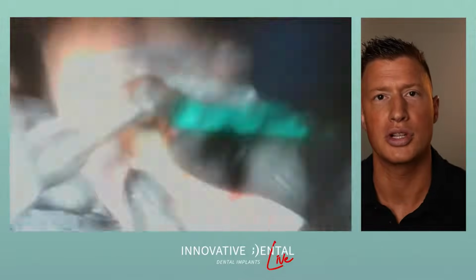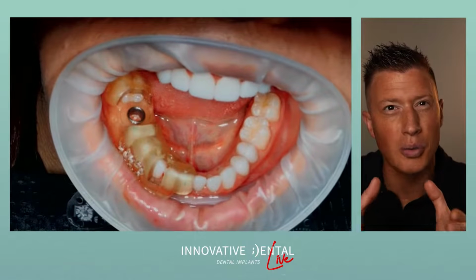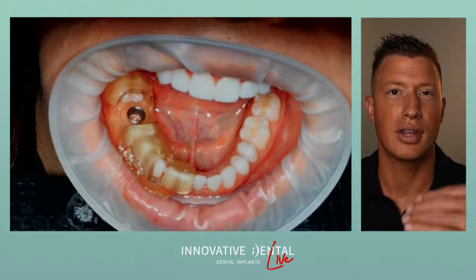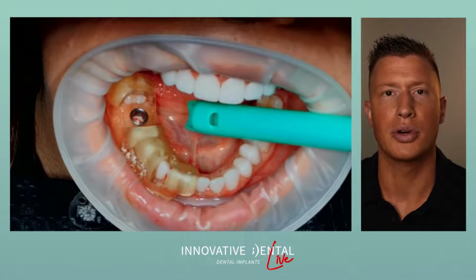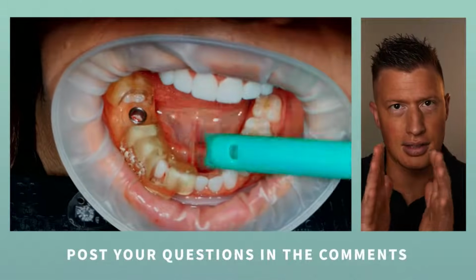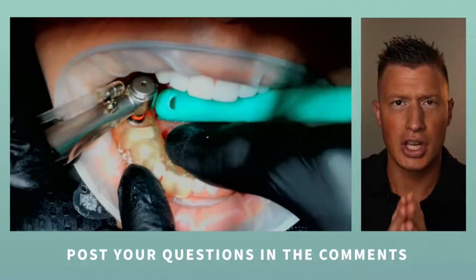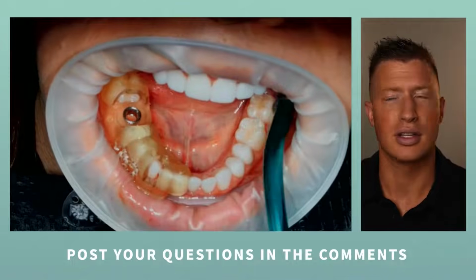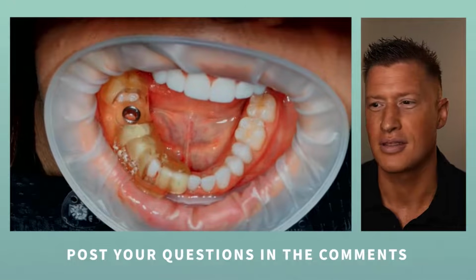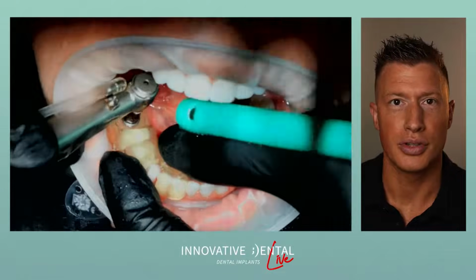Now I'm onto this red, which is a 2.5 millimeter diameter. So I'm making it just a little bit wider than the 2. I'm going to do that with a 6, an 8, and a 10. As we do that, we're slightly making the site a little bit larger, and really making sure that I'm gauging the bone, how it feels. The patient doesn't feel a thing. My wife is very comfortable here. No pain involved.